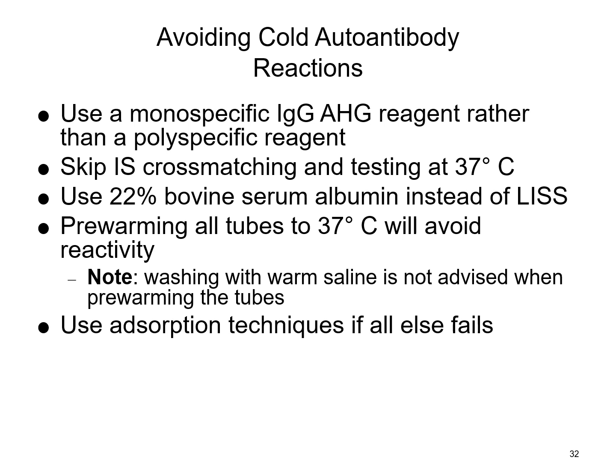So when you're putting it in the incubator, you're going to pre-warm everything, so you're going to pre-incubate your tube with your reagents and things like that. And then you're just going to go straight into that wash phase and your AHG phase in order to detect any reactivity. Now, the textbook notes that washing with warm saline is not advised when you're pre-warming the tubes.